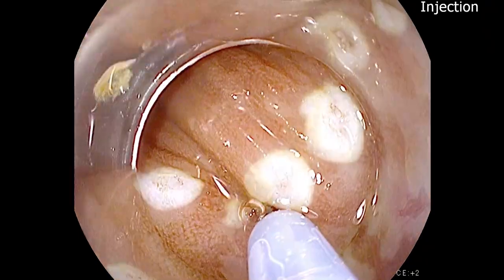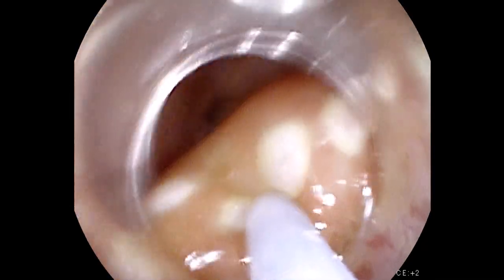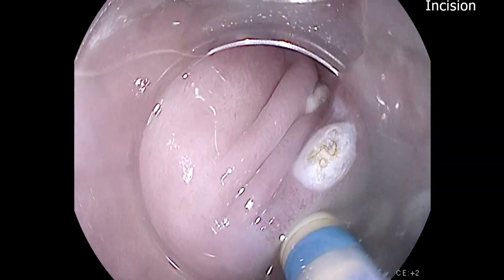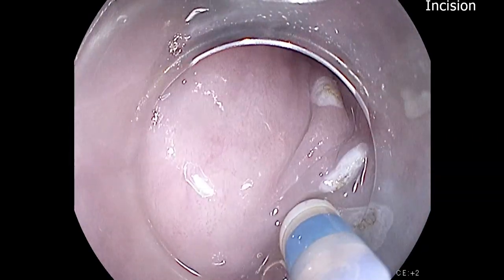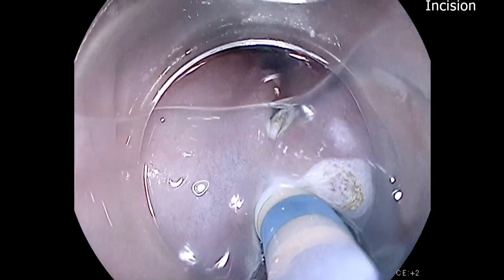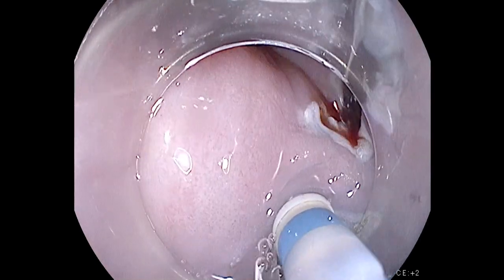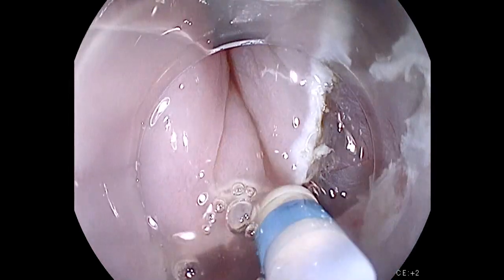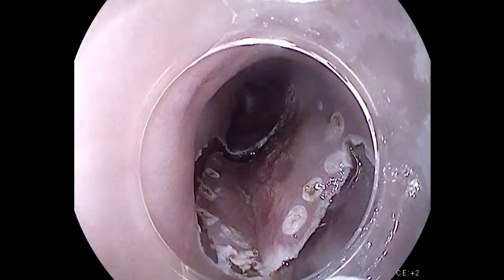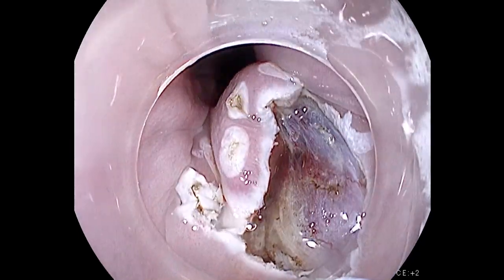A generous submucosal injection at the margins is then performed. We then perform a semi-circumferential, superficial epithelial incision. The reason for the incision being superficial initially is to ensure that the submucosal vessels are not severed, as the bleeding would then impair submucosal plane visualisation. Once there is adequate exposure of the submucosa, we can then select the precise depth of the submucosal dissection.